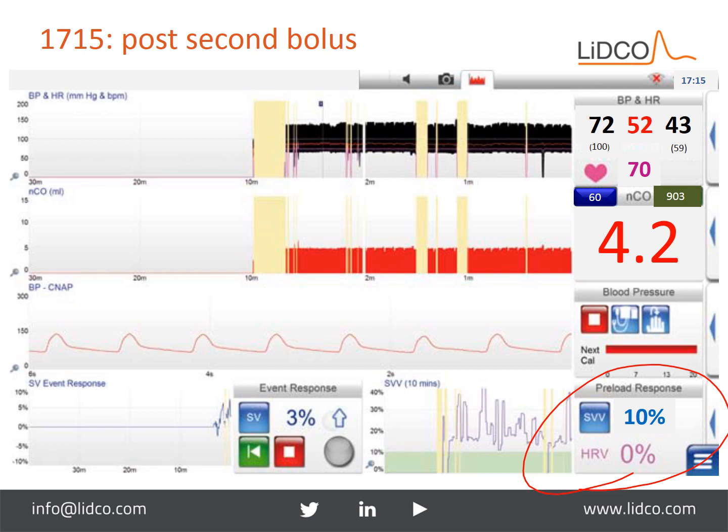Now, he's on the flattening part of the ventilatory waveform. He's at the top of the Frank-Starling curve, which means he's in the non-responder section of that curve. So what are we going to do? Well, let's give him a vasopressor and see how he does with that. I'm concerned if we give fluid by just looking at his blood pressure, we're on the flattening part of that curve, and in fact he will not respond, but we will be doing him more harm. So let's see what happens.